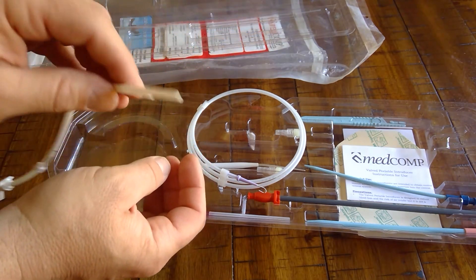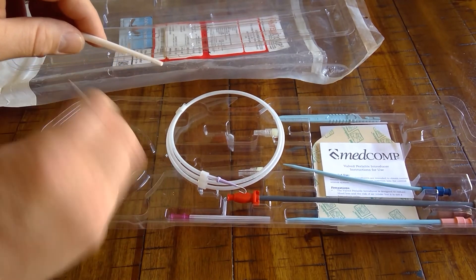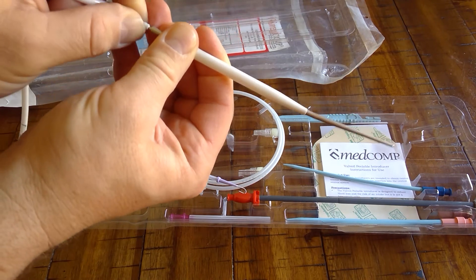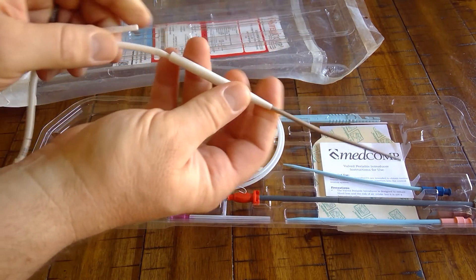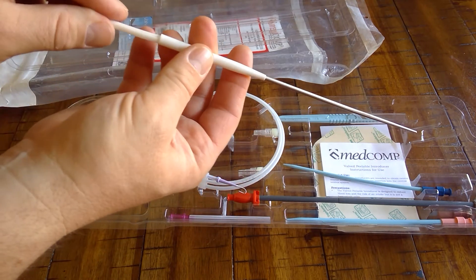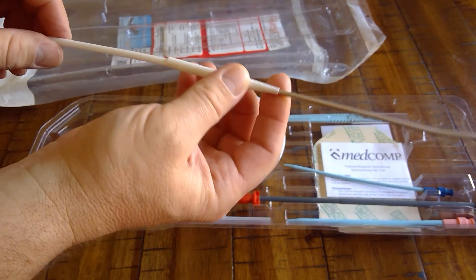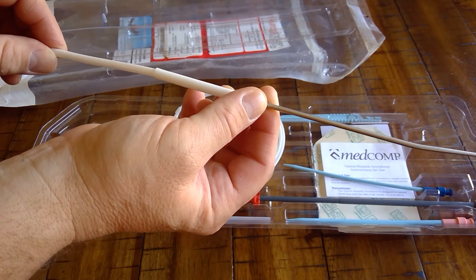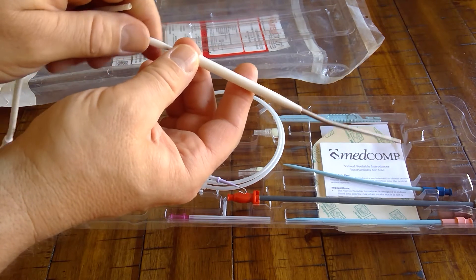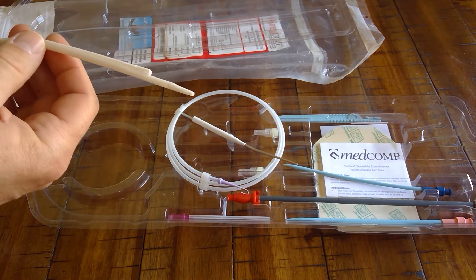Take the tunneling device, put it on the distal lumen with the barbed end, then carefully slide the nose cone over both the distal and proximal lumens. That way, when you pull it through the chest wall up to the venotomy site, both lumens are inside the nose cone and it prevents the catheter from bunching up. Once you get it through to the IJ, remove the tunneler and insert it through the peel-away sheath shown earlier.